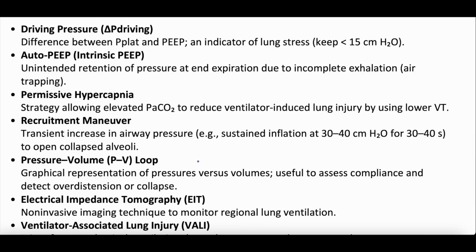Advanced terminology starts with driving pressure. We have a whole episode on driving pressure as well. This is the plateau pressure minus the PEEP, okay? And it can be an indicator of kind of lung alveoli distension. The goal is to keep it less than 15.